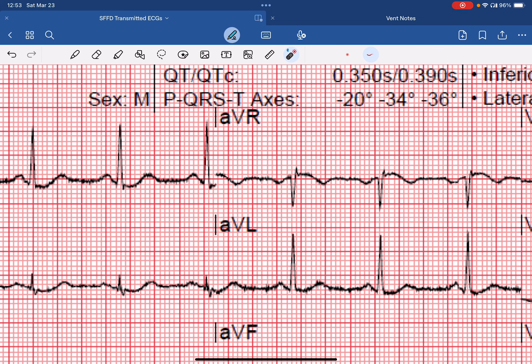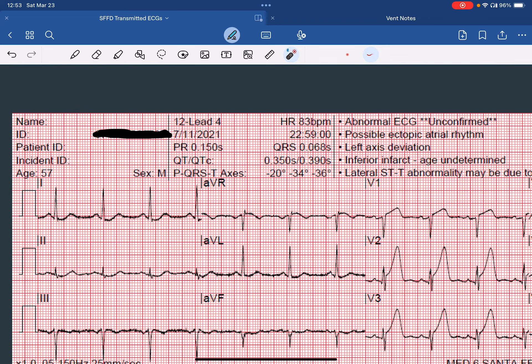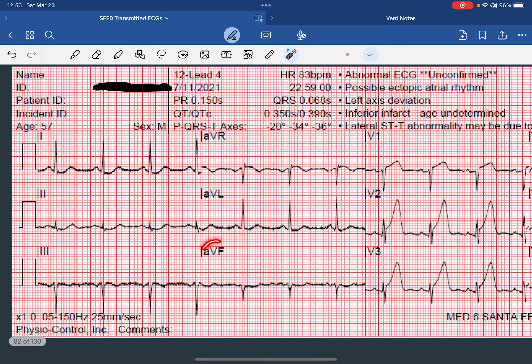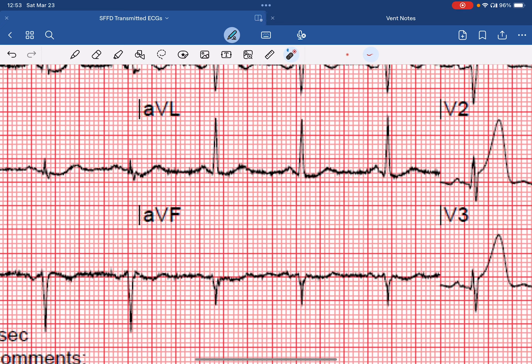Looking at lead AVL, it's not very helpful in this case, but the ST segments may be sagging slightly. Moving to lead 3 and lead AVF, we can see that there are some inverted T waves present, which are suggestive of a reciprocal change. There's also a hint of ST depression in AVF, even though it's not quite a millimeter.